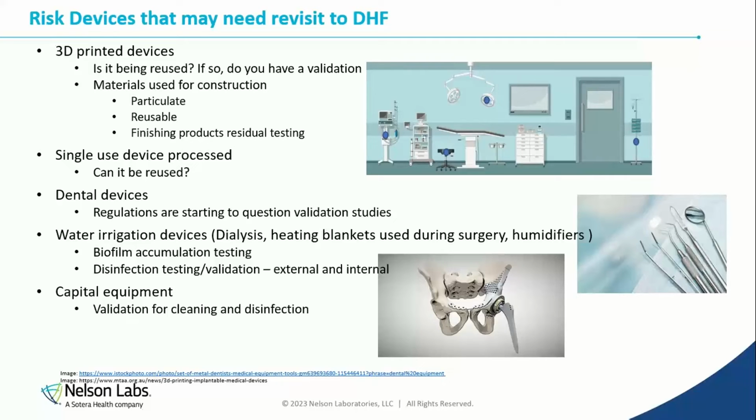Finishing products for residual testing, and so these are the things. Materials of construction for reusable devices is huge when you're doing 3D printed devices, and you want to consider all of these. I'm going to tell you honestly, we get these all the time. Maybe 1 out of 10 make it through. So you want to make sure the polymers or whatever mixed material that you're using will withstand the chemicals, will be non-porous, and will not soak up all the chemicals that we use for cleaning. And during cleaning, it will not break down either, because that's what we see as well.